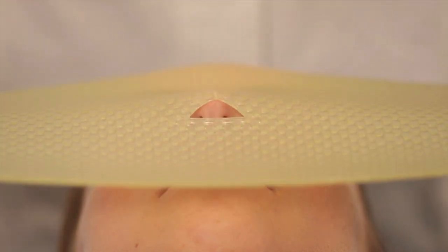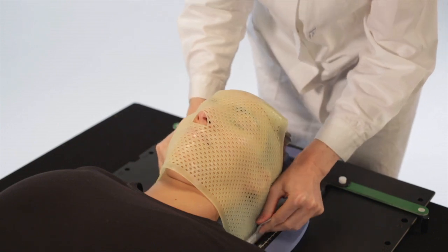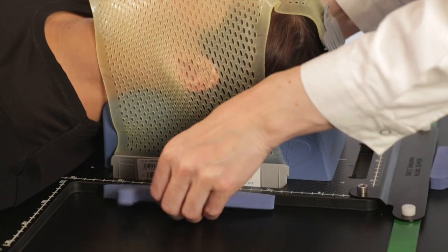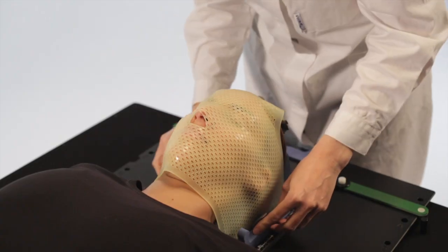Position the pre-cut mask over the face of the patient with the top of the nose hole on the tip of the nose. First, insert the two lateral L-shaped profiles into the base plate and secure them in the slot with a foam handle of the appropriate length.